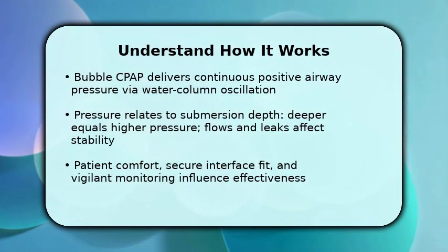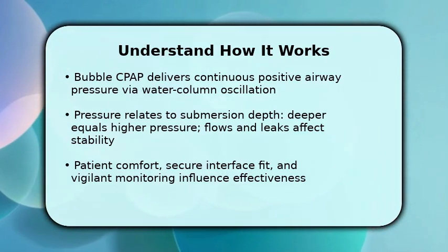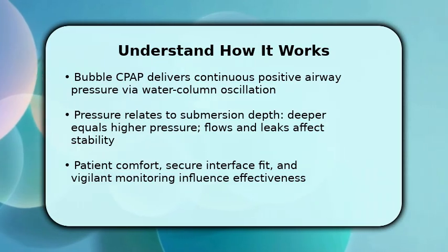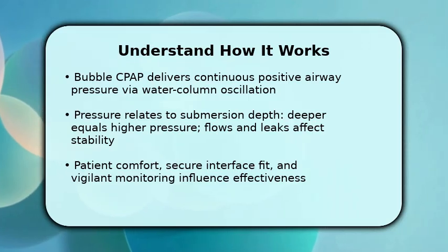Once you understand the components, focus on the physiological principles rather than procedures. Bubble CPAP generates continuous positive pressure through a water column. Oscillations arise from bubbling and may improve gas exchange.